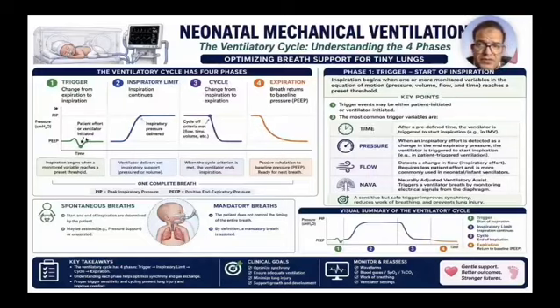Then pressure, as we mentioned here, is either patient initiated or ventilator initiated. Here, the patient initiated some inspiratory effort, detected as a change in the end expiratory pressure, and the ventilator is triggered to start the inspiration. And when I say trigger, don't forget to set the trigger sensitivity on the ventilator machine, because adjusting the sensitivity of the trigger helps better synchronization.